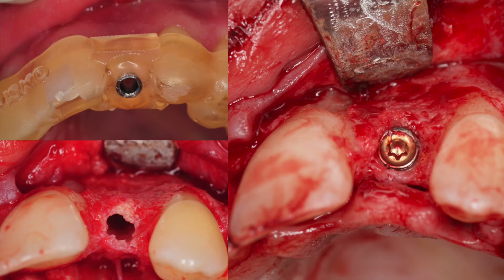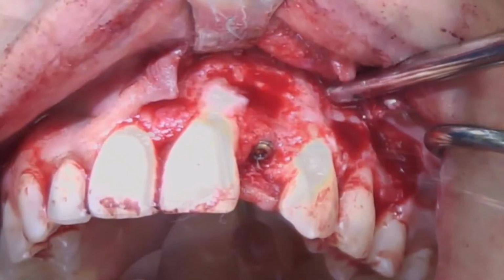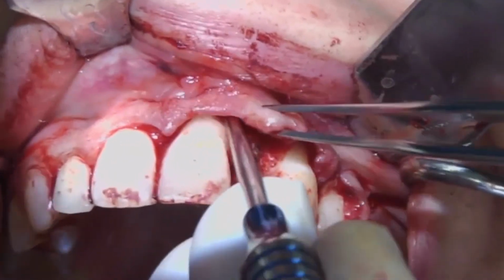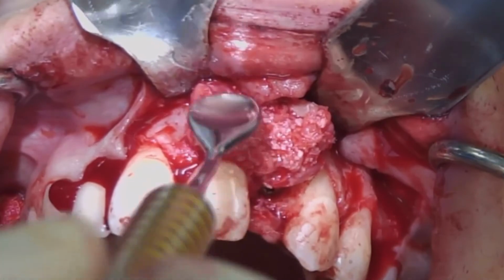Other thing that we can kind of see also, aside from the bone augmentation, is the very thin tissue biotype on the labial aspect of number 9, which was there from the get-go. There was essentially bony dehiscence on the buccal aspect of that. This just shows the implant and the second bone augmentation.